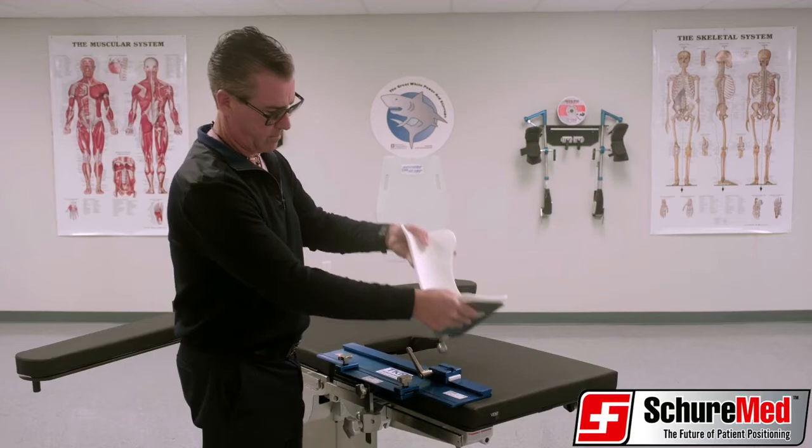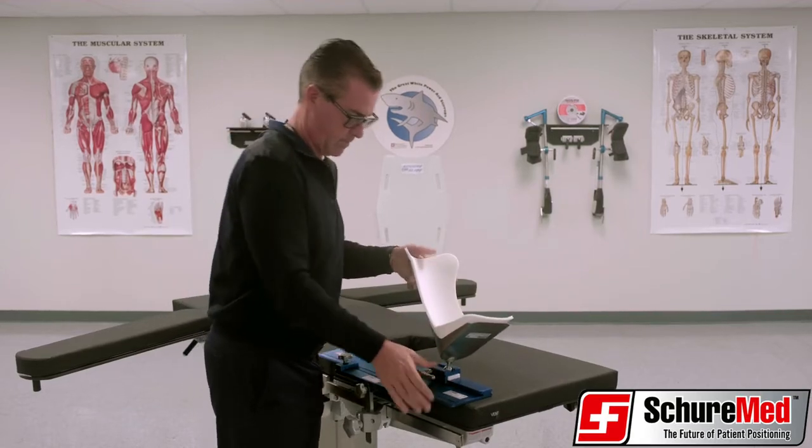Finally, insert the ball of the boot into the adjustable slide block and secure with a locking handle lever.